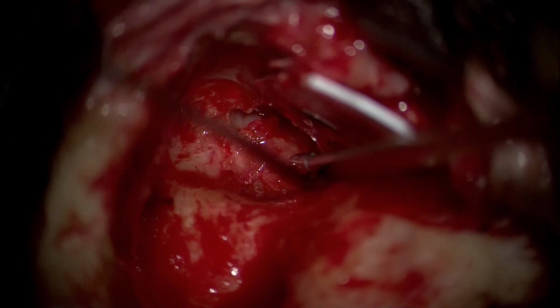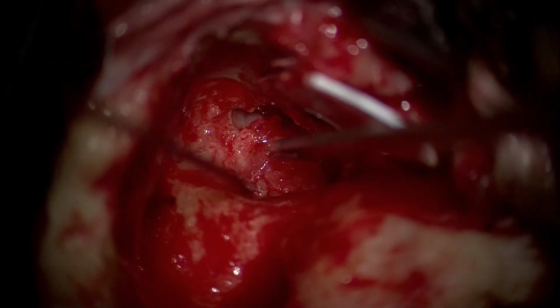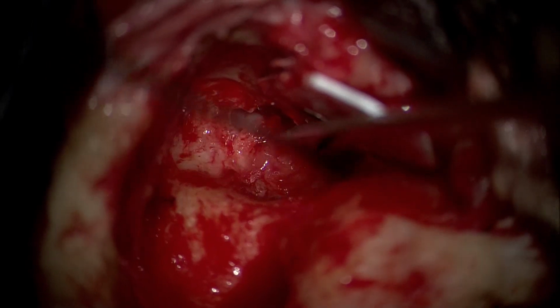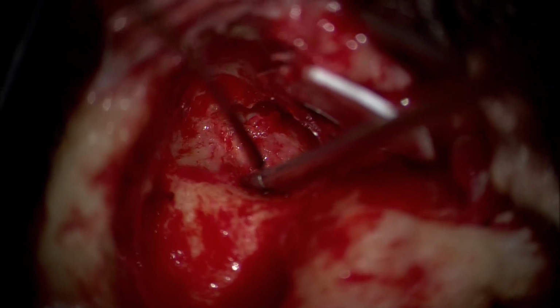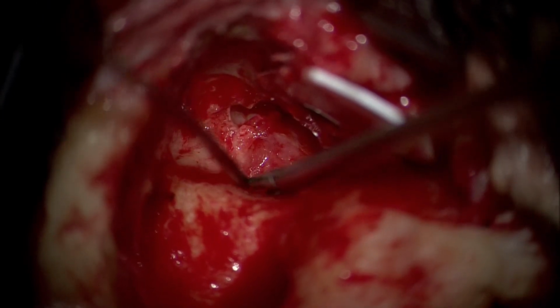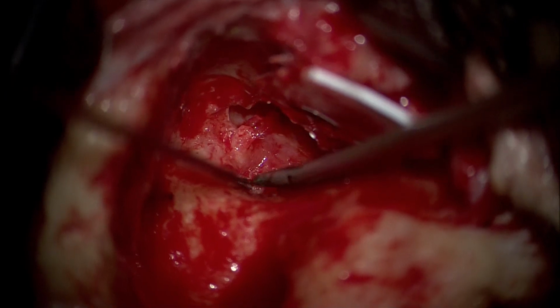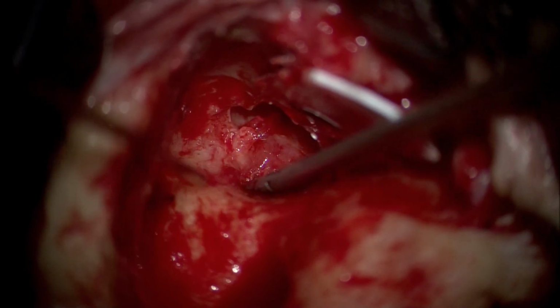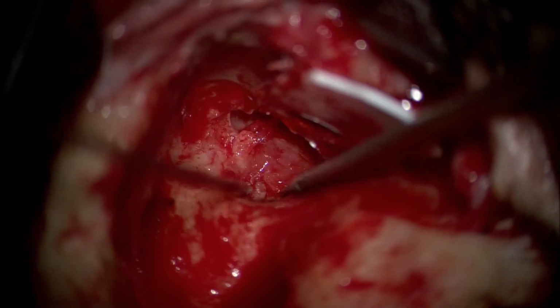So we're using here a very fine, microfine crocodile forceps, especially used for this purpose, because we do not want to be using a larger cup forceps, as that has the potential to pluck out the whole stapes, even with a fraction of a millimeter of inaccuracy on the stapes head. So the point is just to pluck out the finest part of epithelium, which you find difficult to come at with the suction.